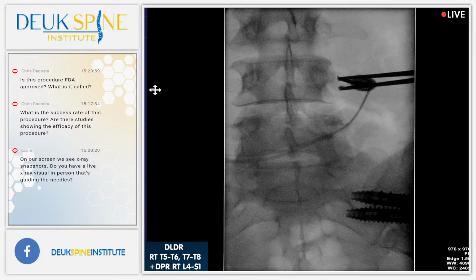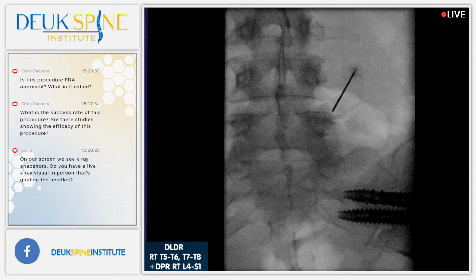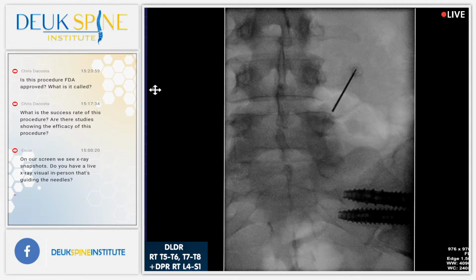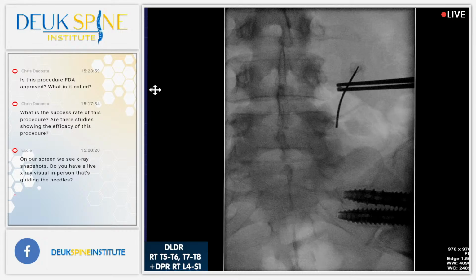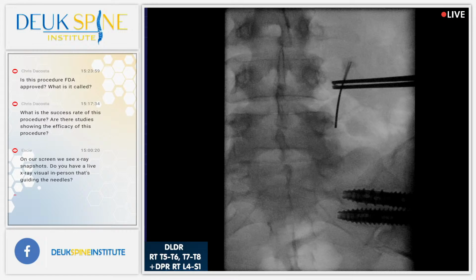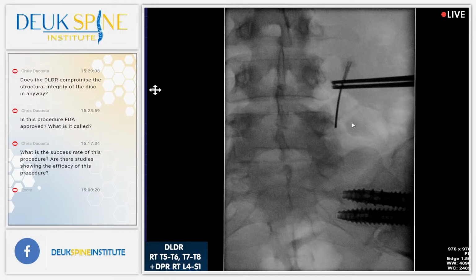Shot. Okay, hitting the superior facet. Shot. Still too high. Shot. Too low. That feels pretty good right there. Let's just see where we are. Shot. How is she ventilating? That's almost 100%. That's the perfect spot right there. Shot. Okay, see where the tip of that needle is, guys? Point to it. That is exactly where you want to be. You see the transverse process? Show them the TP.